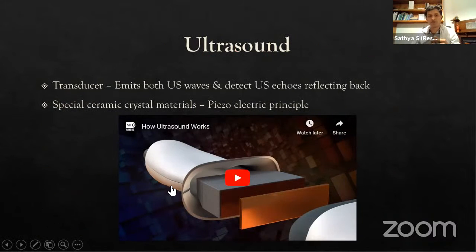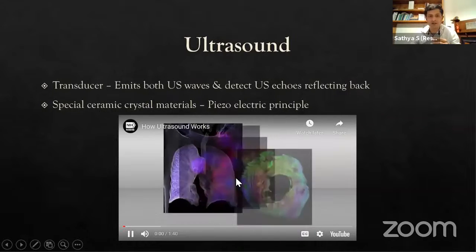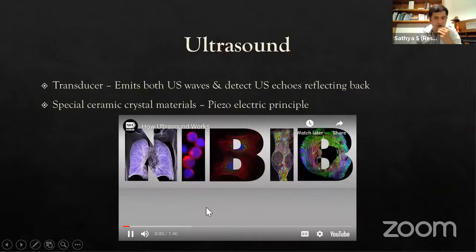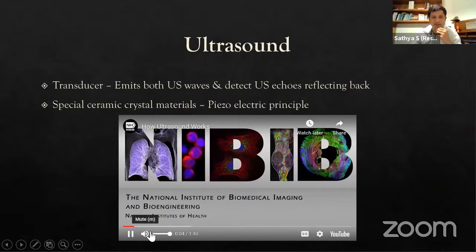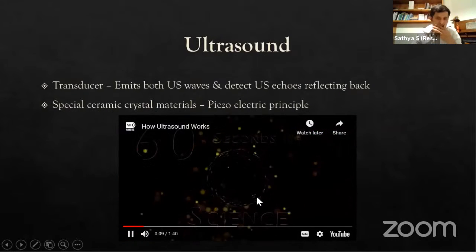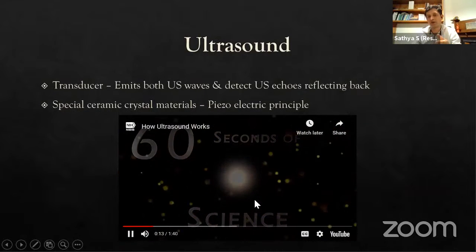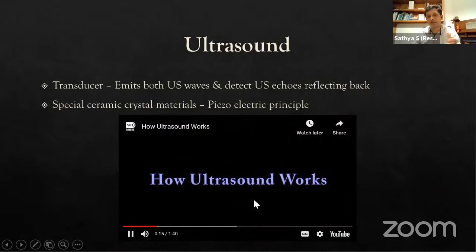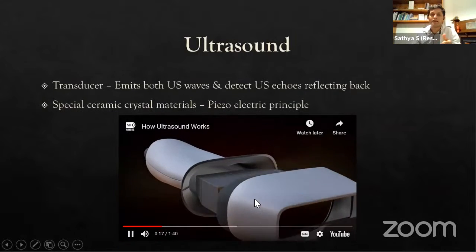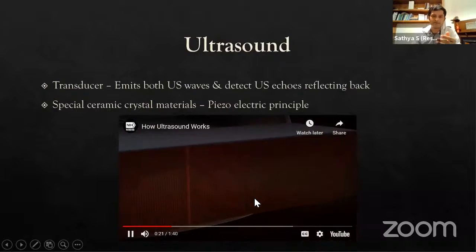So here again, I want to show you roughly how ultrasound works. If you are unable to hear the audio, I'm sorry about that. I hope you're able to hear something. Here they are showing, from the National Institute, a 60-second video of how ultrasound works and how it emits sound waves using the piezoelectric effect.